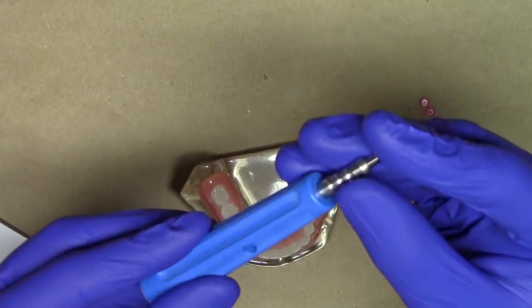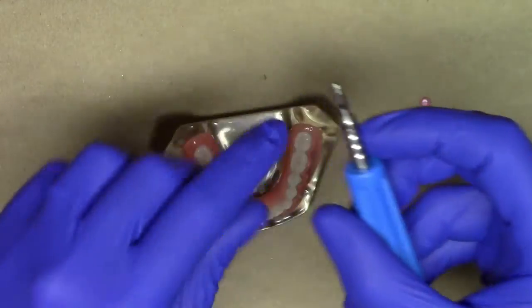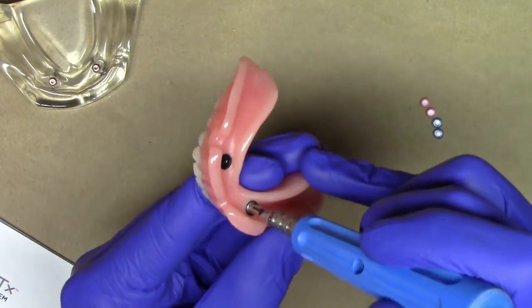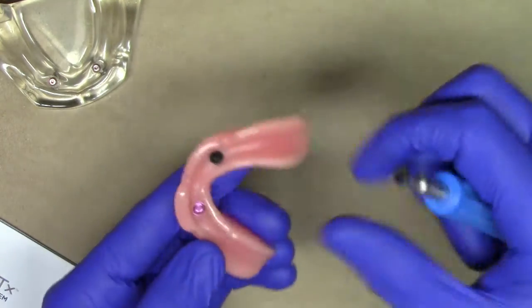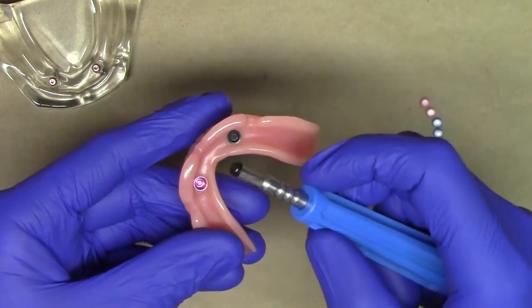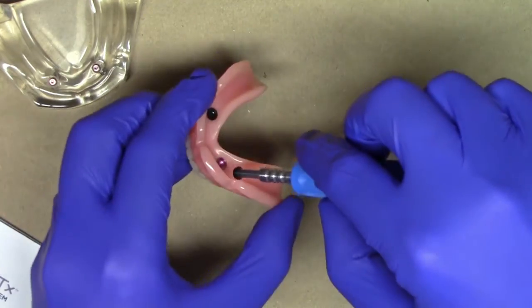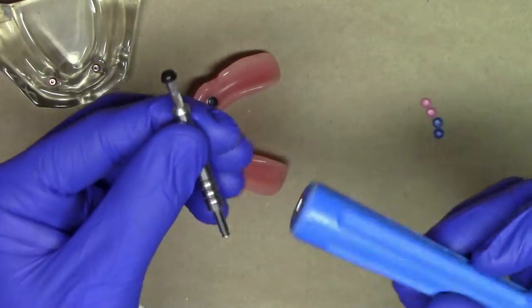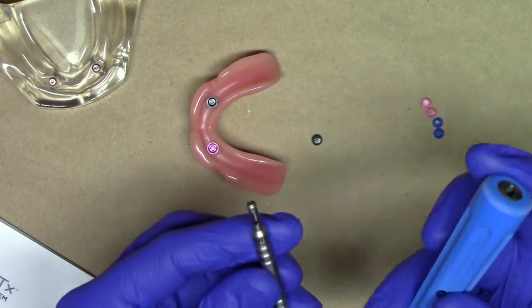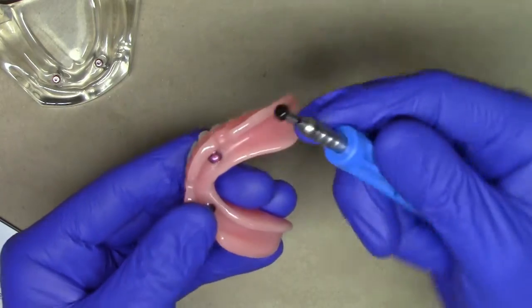First, we're going to assemble it properly. I've just picked up my processing insert, so I'm going to place my 'out' end facing up — meaning I can read the text that says 'out.' Removing my patient's denture from the mouth, I can see the processing inserts. I'm going to insert vertically and then twist. ZestAnkers says: make it simpler, make it faster, make it much less complex — just insert and twist out. By doing so, you remove the metal part of the tool, insert it into the back end, and it easily pops the insert out onto the bench top.